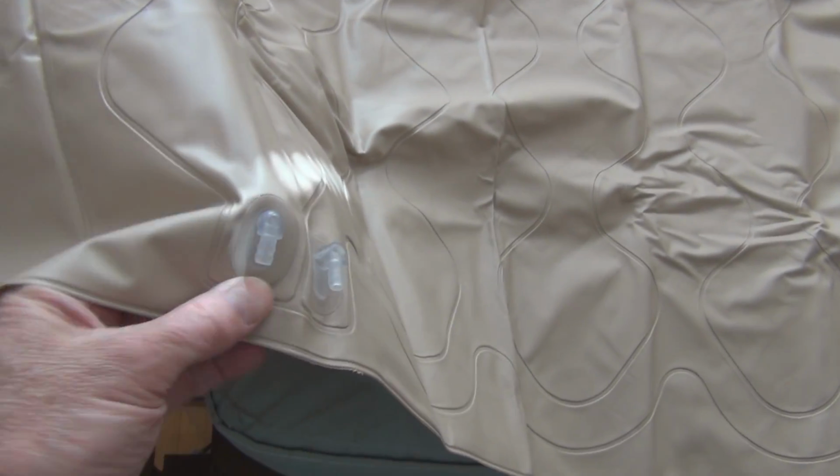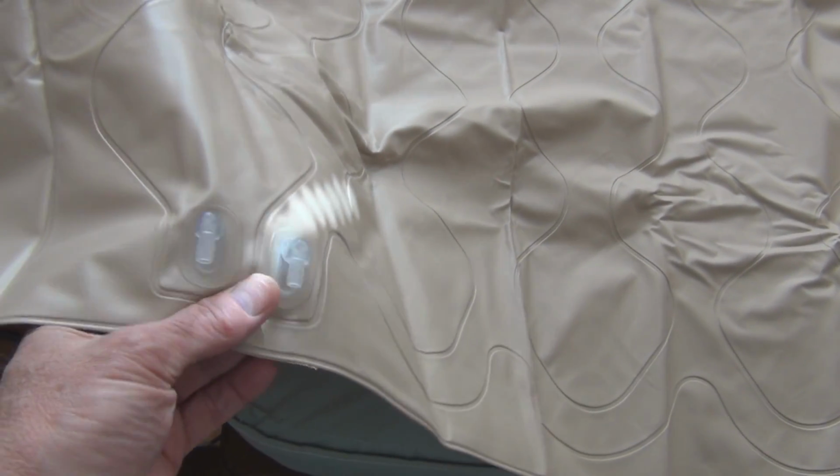You know, I started cleaning off the mattress before I put the alternating pressure pad down, and I realized it's probably a good idea to turn the mattress over and then also turn it 180 degrees, so it's a little bit different from the contact point, so it's not always the same. So here it is laid out, and I have the two hose connections right here on top, same orientation as the previous one. And again, these extra flaps you tuck in underneath so it's not going to be slipping and sliding all over the place.